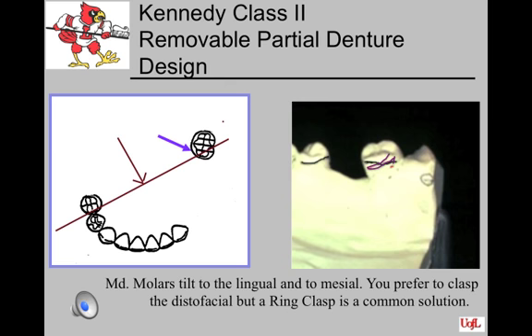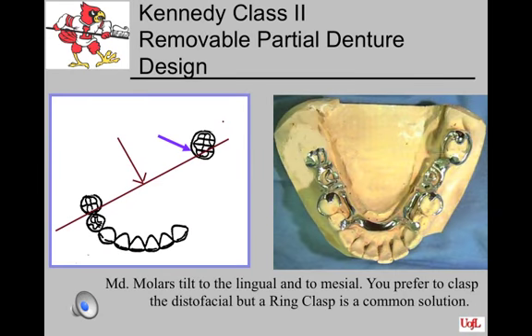That way I do not have to mutilate my tooth as much in order to get the first 2/3 of that direct retainer to be above my survey line, as it has a lower survey line on that position on the tooth, and my 0.01 retentive part is below the survey line on the mesial and no higher than the middle third of the tooth.